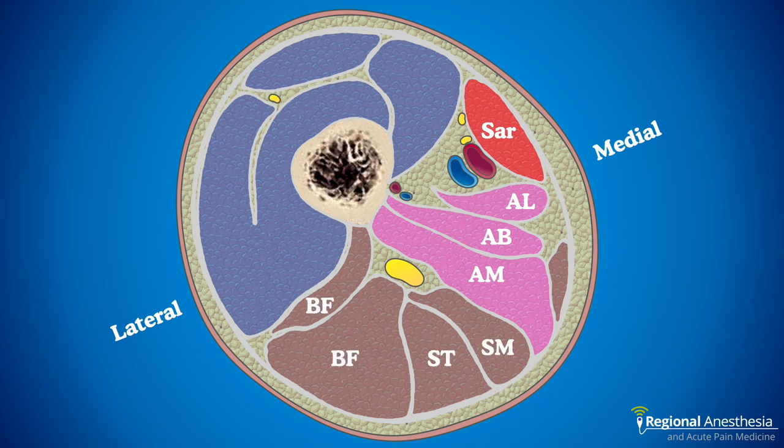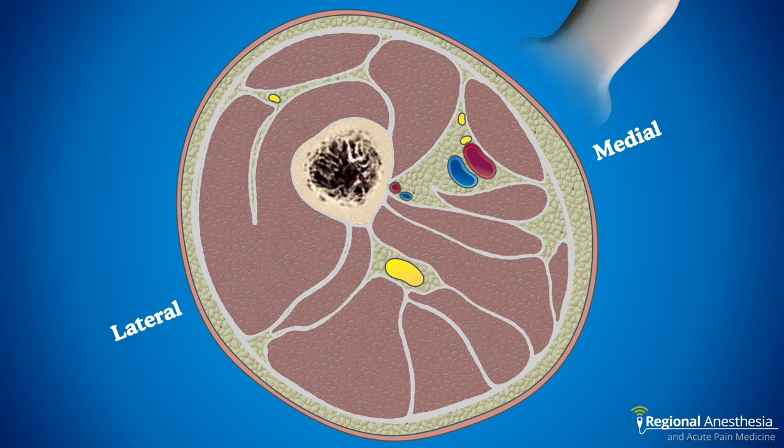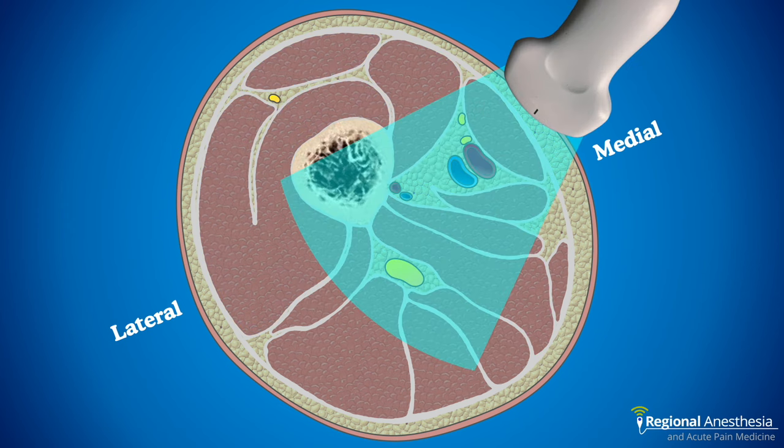And finally we have our hamstrings — biceps femoris, and semitendinosus and semimembranosus. Tucked in between adductor magnus and the hamstrings below is our sciatic nerve. With our probe positioned on the anterior medial thigh, we can image all of these relevant structures.